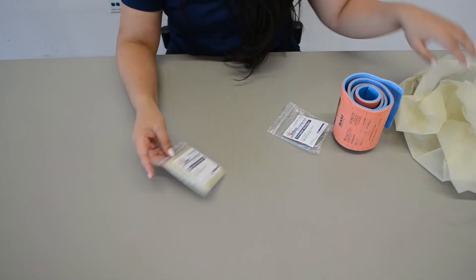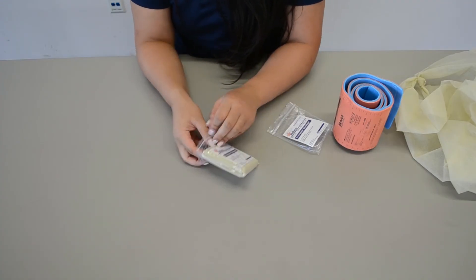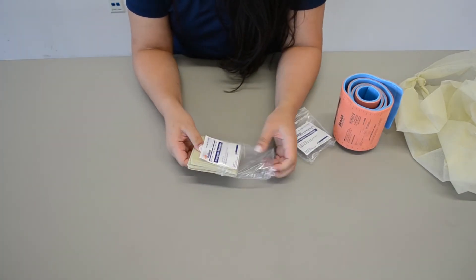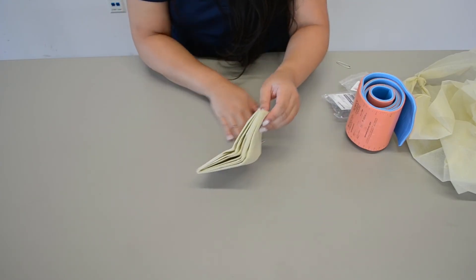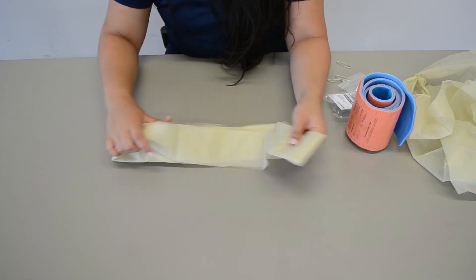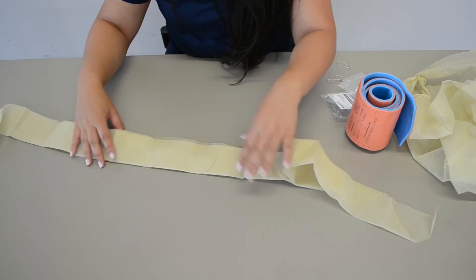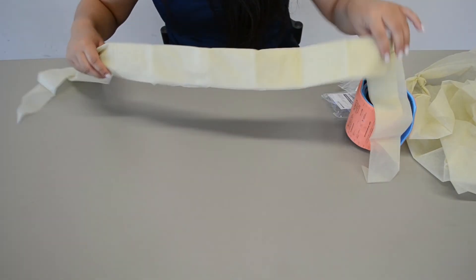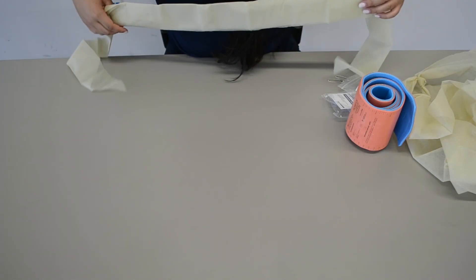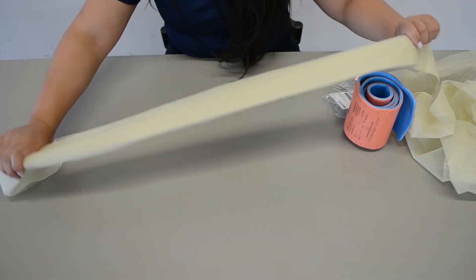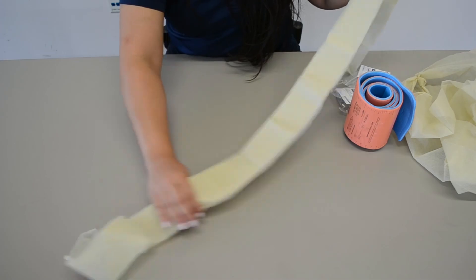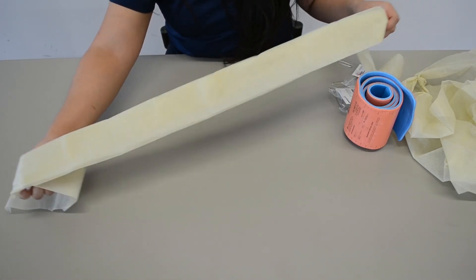And then for your second triangle bandage, this is going to be your swat. So you're going to open this up and take out the safety pins. Usually you can leave it like this depending on the width of the patient, but this is going to go over the patient's arm and around their rib cage, and you're just going to tie it in the back. So just leave it like this and then secure it on the patient's back.